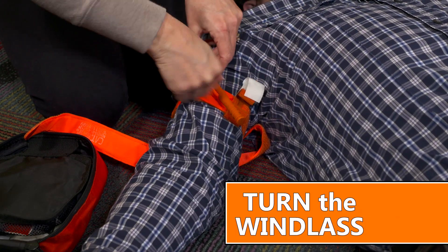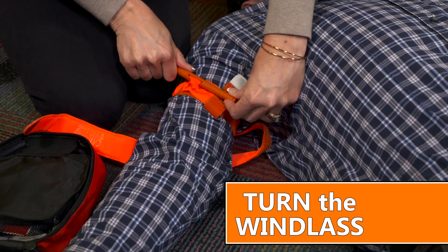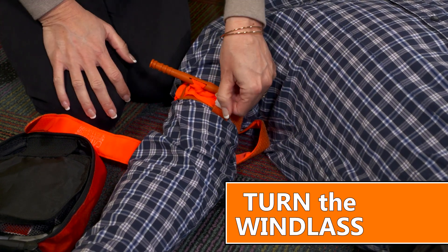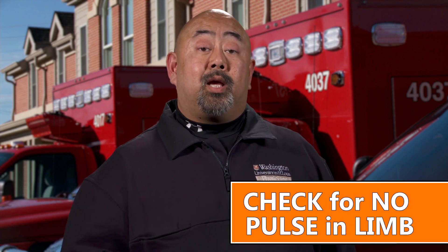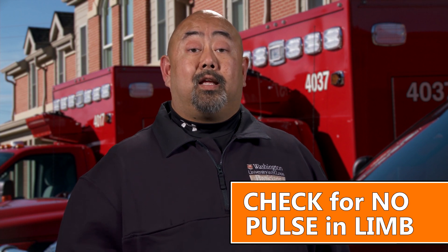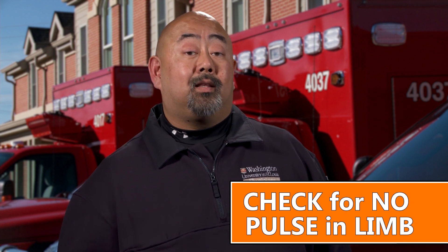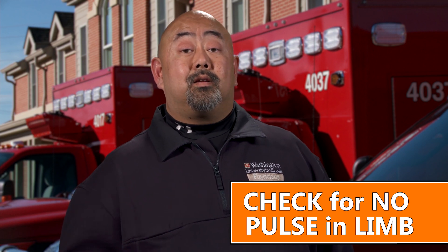Third, turn the windlass. If you pulled the strap tight enough, then you should only be able to turn the windlass rod one or two times — three at the most. If you're able to turn it more than three times, then chances are the strap is not tight enough. And finally, check to make sure there is no pulse in that limb after placing the tourniquet. If bleeding seems to have stopped but there is still a pulse in that affected limb, then another serious medical complication could develop.